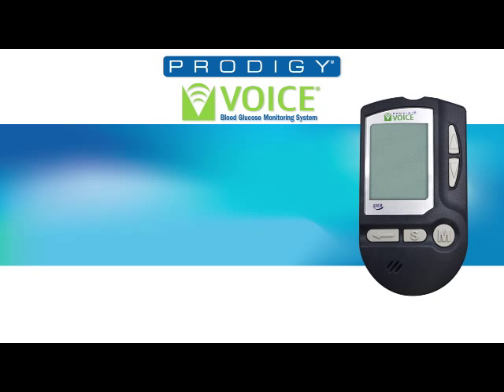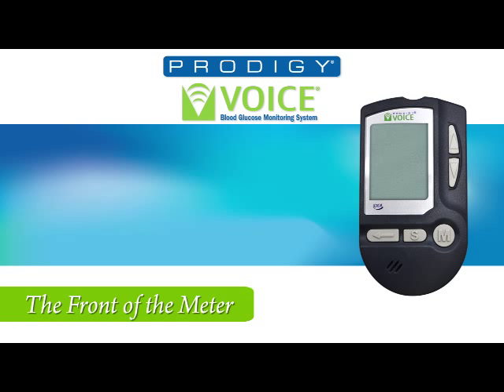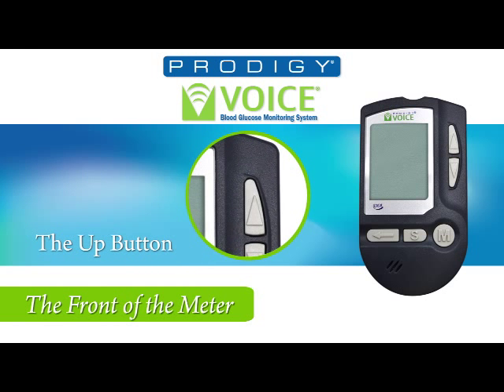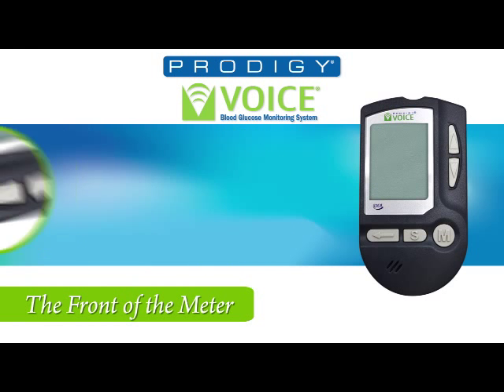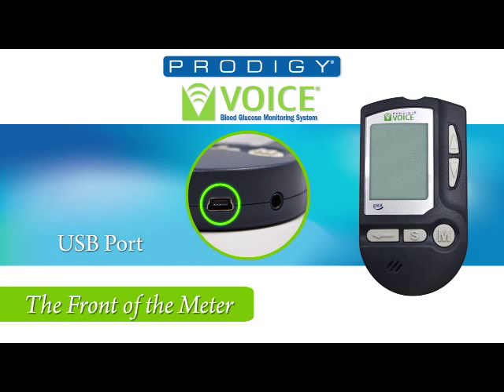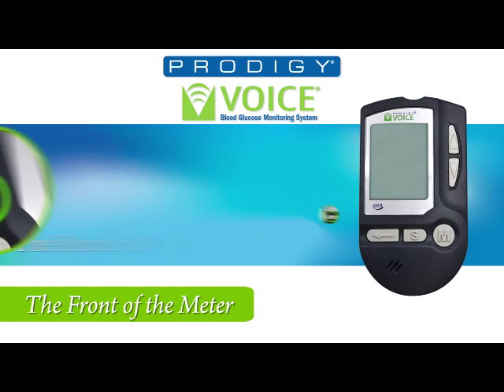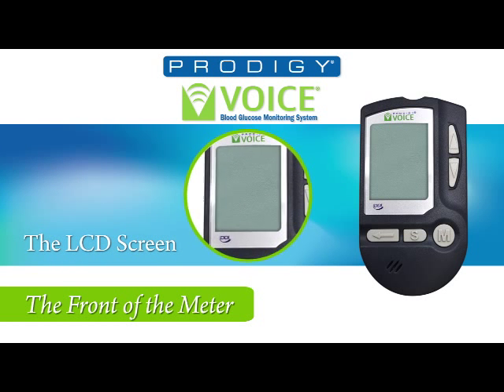Let's take a look at the front of the meter. Starting from the top clockwise, you'll see the test strip slot, the up button, the down button, then the main M button, the earphone jack, USB port, speaker, set button, repeat button, and the LCD display.